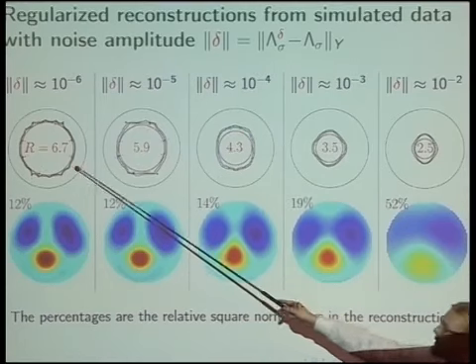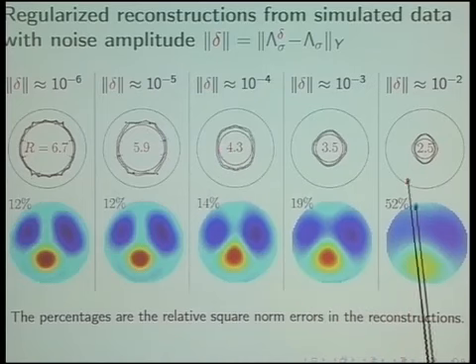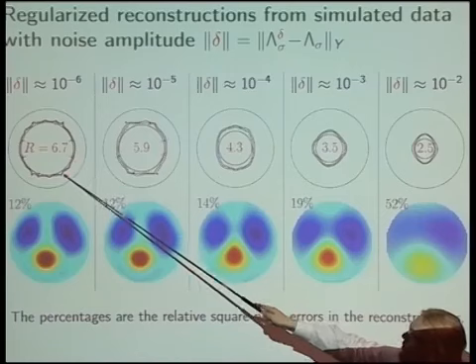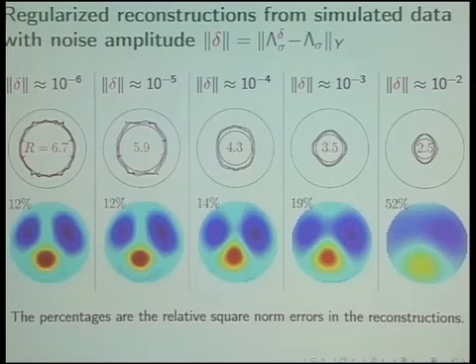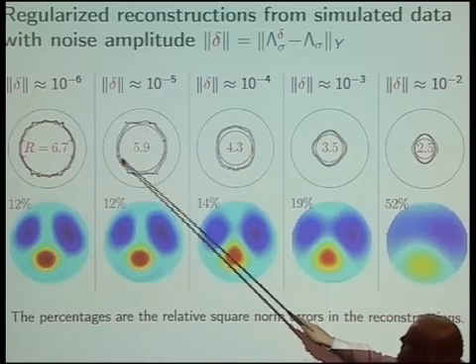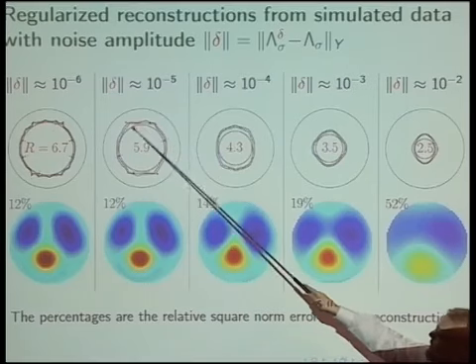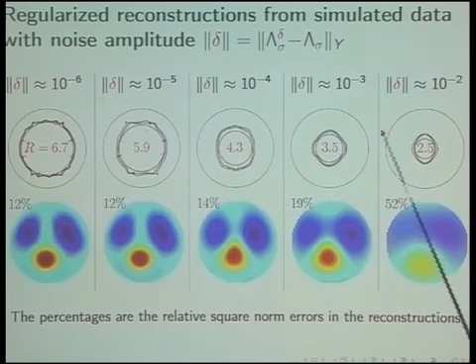And now here you see these truncation radii. What I did here is I cheated a little bit. Let me explain. These black things you see here, this is where the computation of the scattering transform breaks down. So I cheated and computed the real scattering transform. Then I computed the scattering transform honestly from boundary measurements. I compared them, and these black lines show when the computation breaks down, I think when it's more than 10% error point-wise. Then I just pushed this red cutoff frequency as big as possible while staying in this relatively high quality computation.